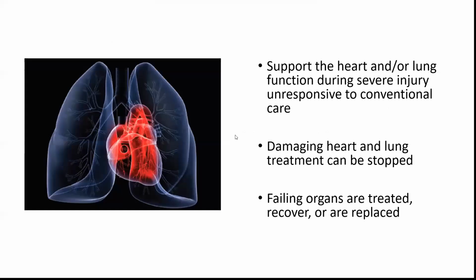So based on that literature, some people drew from it that ECMO is worth trying, especially in those patients that have severe ARDS. Other people, again, are in that undifferentiated category. But when you add the evidence to the ECMO physiology, I think that's where I personally really get sold. Because the evidence, as we stated, is not overwhelming, but I think it shows some potential benefit of the modality. So we're talking about ECMO physiology. We know that ECMO is in place. We talked about VA and VV.